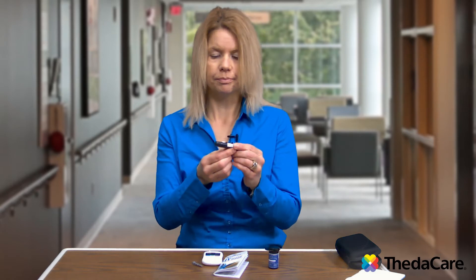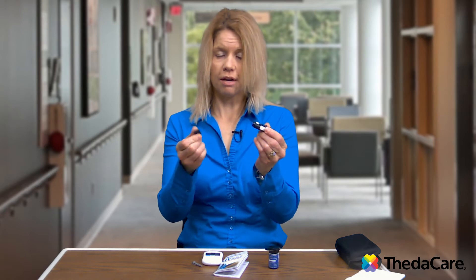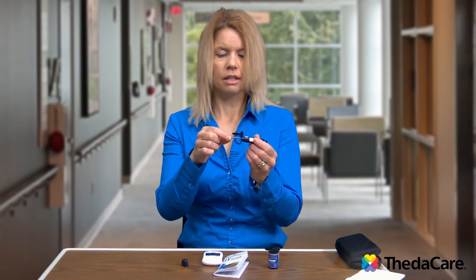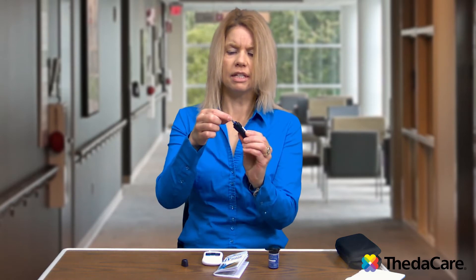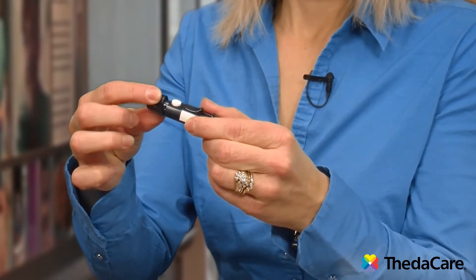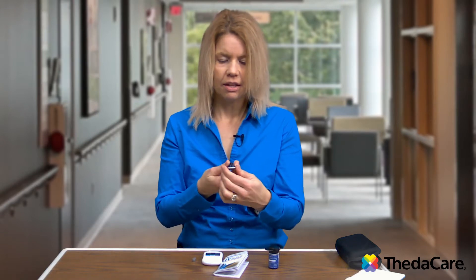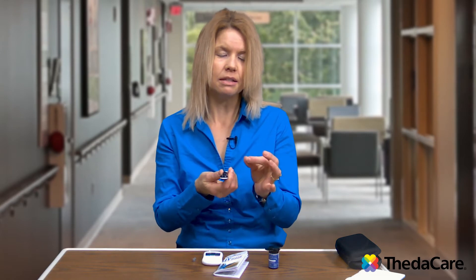First we want to put in a new needle, or lancet. You're going to twist the top — on this one it pulls off; on others sometimes they just pop off, so it does vary. You take your clean new lancet and click it in. Then we're going to take the safety top off, twist it and pull it off, and there's the needle. Then we'll hide it and put the cap back on, so you will not see it when it pokes your finger. On each lancet device there is a dial with numbers, and that dial tells you how deep that needle is going to poke.